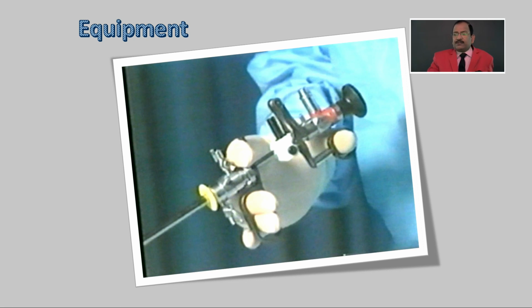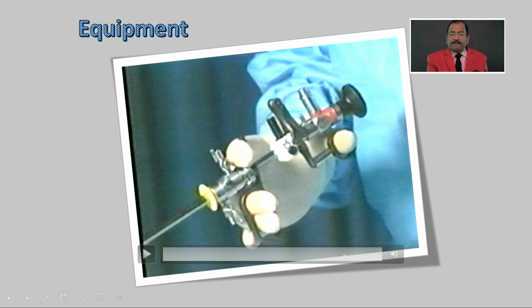So this is hysteroscope. Now I have a question, what can this hysteroscope not do? First, what can a single channel not do? Single channel can only diagnose any pathology like myoma, polyps, and different phases of the endometrial cycle you can diagnose, proliferative phase, secretory phase, am I right?